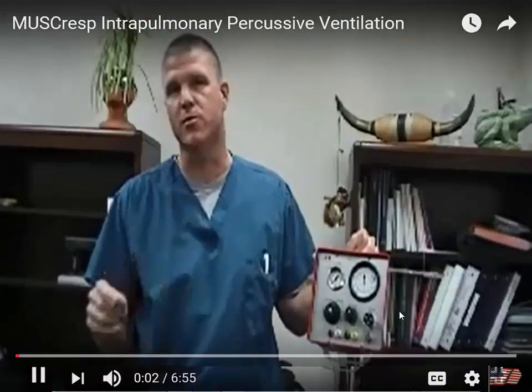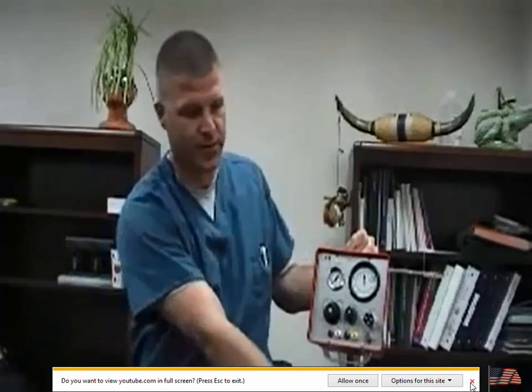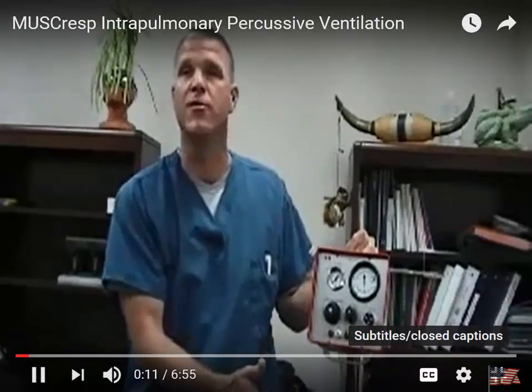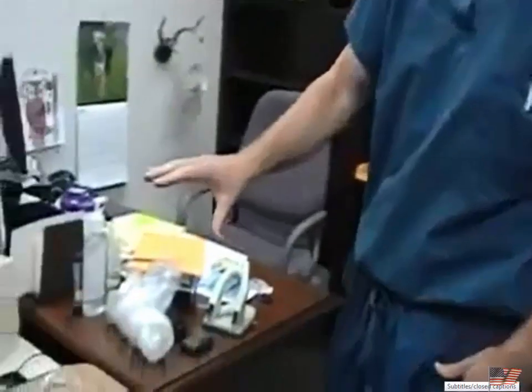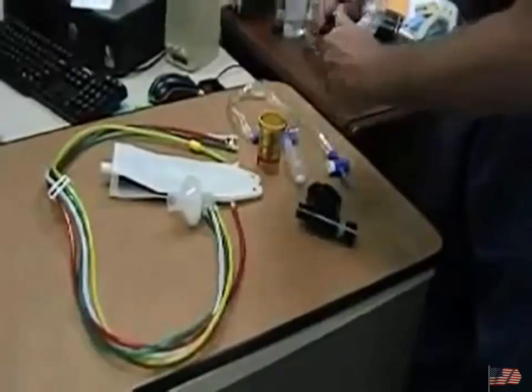Hey everybody, it's Scott Krigo. We're going to go over how to do an IPV treatment on a mechanically ventilated patient. Alright, so we've got the IPV machine, we've got a 50 psi source on our oxygen tank, but we would typically be using an O2 source from the wall. Alright, and then all of our material over here for our circuit is right here disassembled. Okay, and I'm going to show you how to put all this stuff back together.